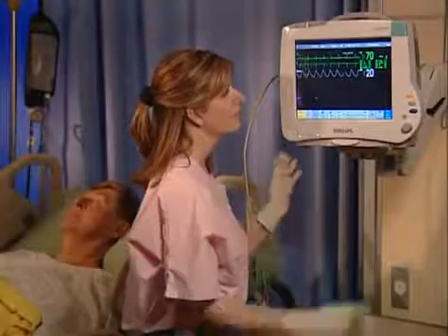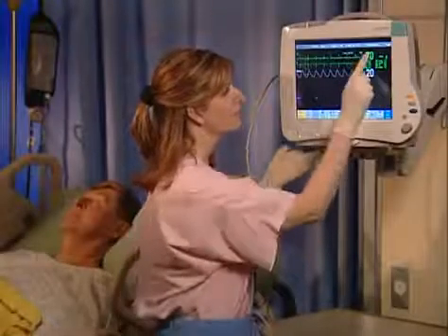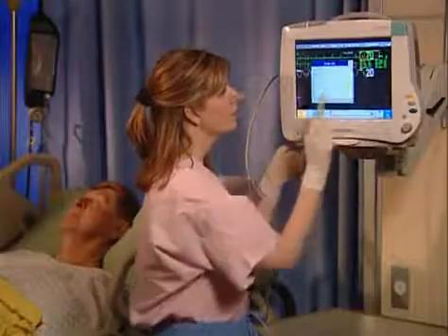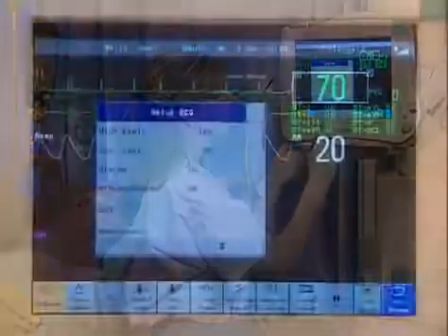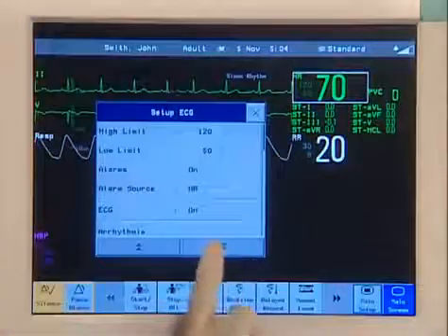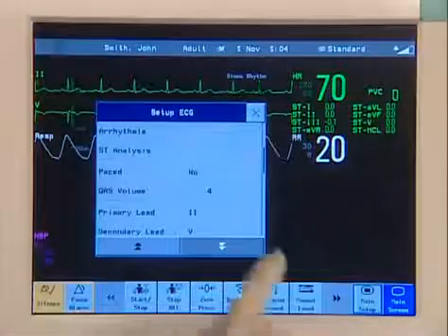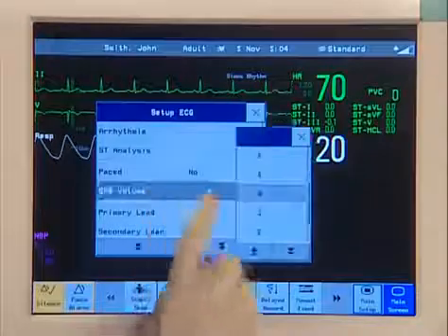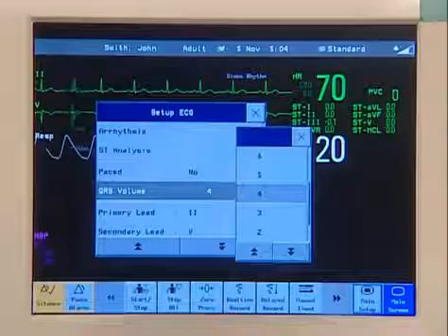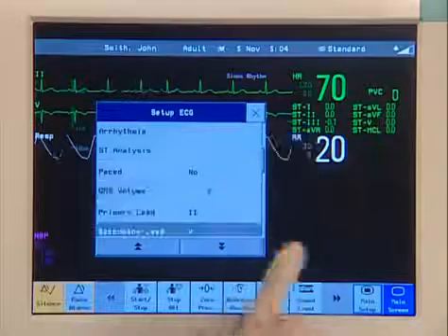Select the heart rate numeric to open the ECG setup menu. To adjust the QRS tone volume, select QRS volume and then select the appropriate volume from the pop-up list.